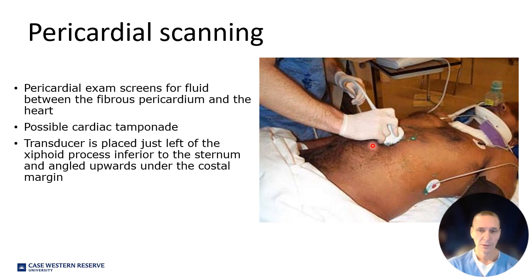Now, you're going to see how we can roll through the liver and find the heart that way. I have found that it works best to visualize where the heart is and imagine that you're holding some sort of flashlight and just pointing towards where you think the heart is. However, this may be different for others, so we'll show you several ways.